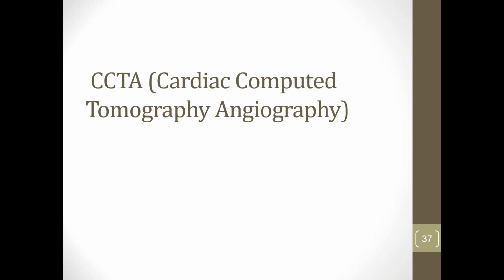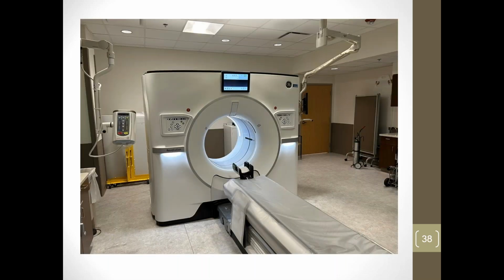Another related, but not necessarily the same, procedure that they use is cardiac computed tomography angiography, which is a big fancy way of saying a CT exam of the heart. And so what they do is they will use a CT scanner. Say if a patient presents at the ER, they may have some of the symptoms of a heart attack, but not all of them, or they're not quite sure if they need to call the cath lab in. They may run them over to CT, and they can do a nice scan of the heart and see if there's any narrowing or constrictions inside the coronary arteries.